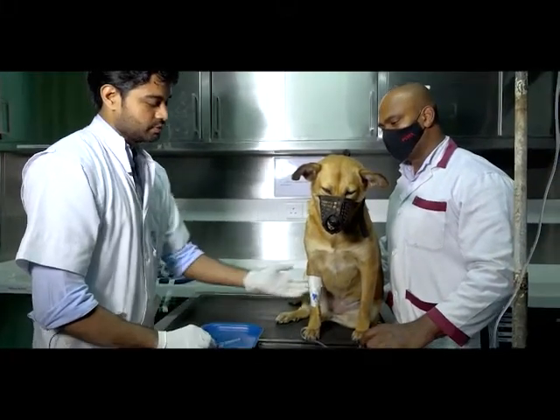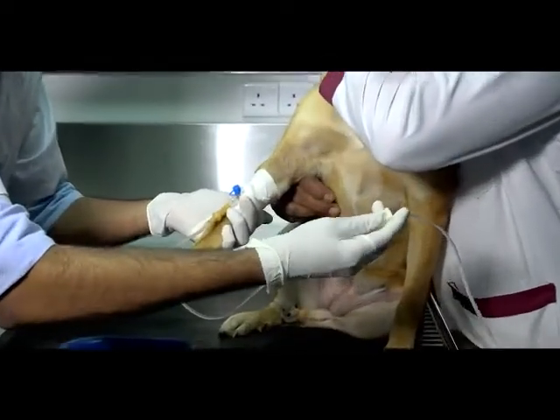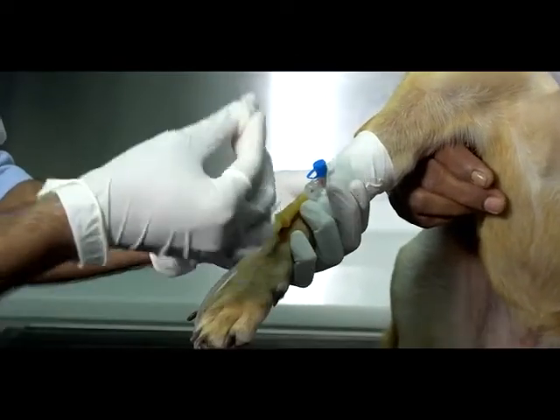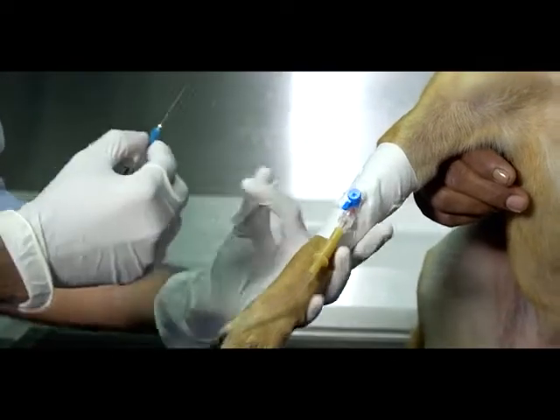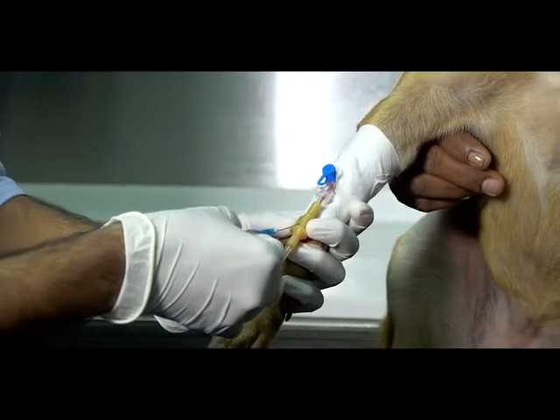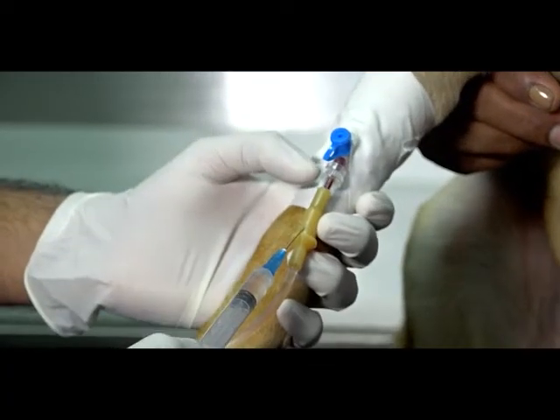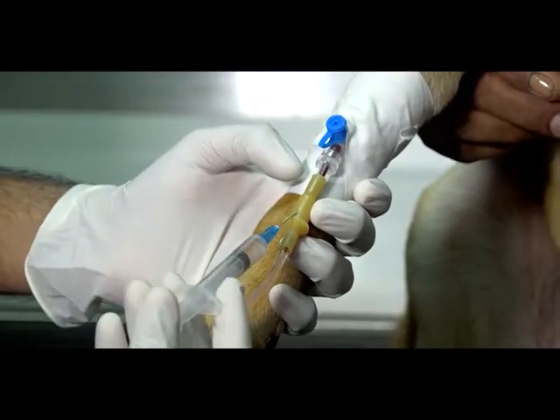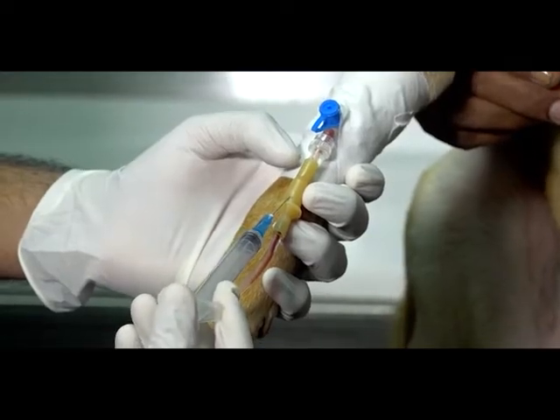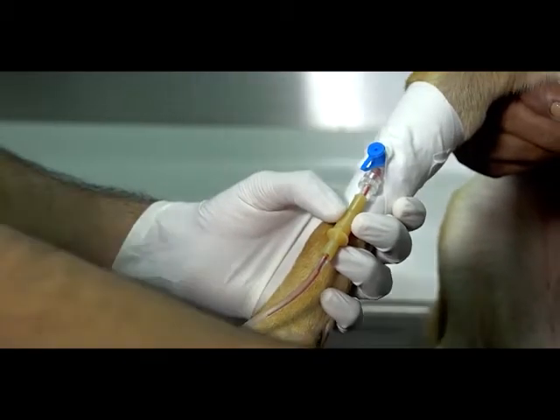So we're going to give the IV injection. For that we would gently lift the arm, close the infusion set like this, then scrub it using the surgical cotton we have, and then place the needle at the hub, and then you have to pull the plunger back, so there's blood coming, it's definitely inside the vein. You can gently give the drug. Take it out, and then you would open.